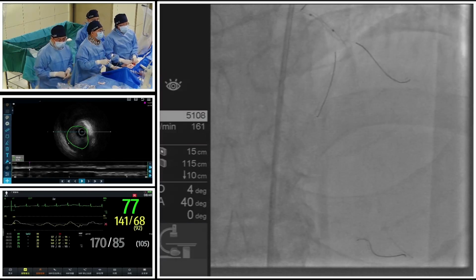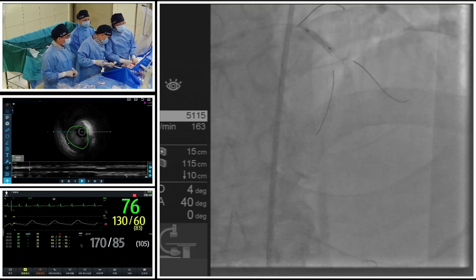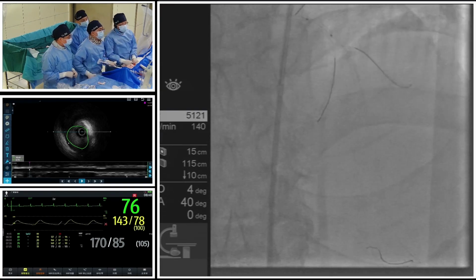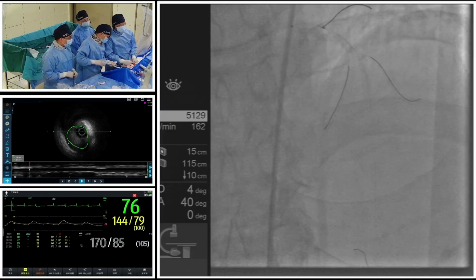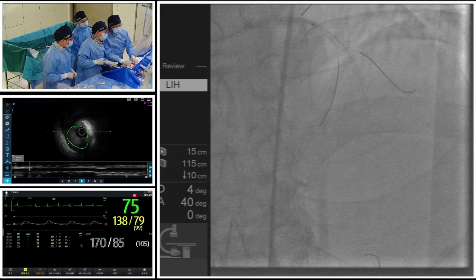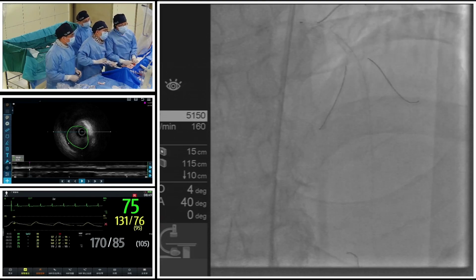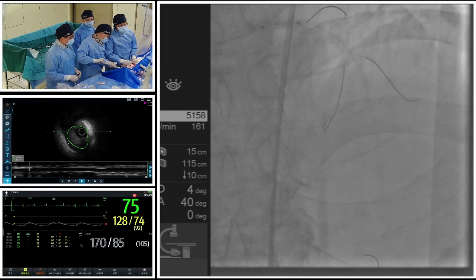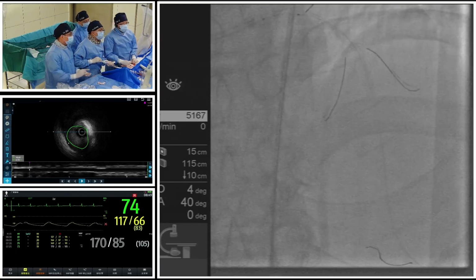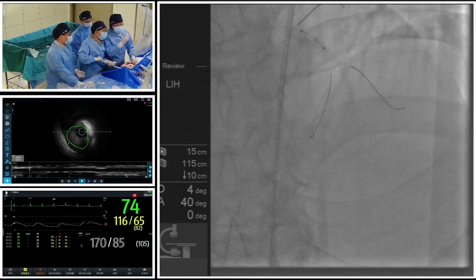So we continue with the topic that we just talked about. There are several potential risks: losing the side branches, big hematomas, and dissections. And I think in this case, the other risk is converting one-stent strategy to a two-stent strategy. If you use a scoring balloon or a very big balloon to dilate the bifurcation site of the left main trunk, there is a high likelihood of causing plaque shift to the circumflex ostium or some minor dissections to the ostium of the circumflex, which is relatively difficult for the following procedures.